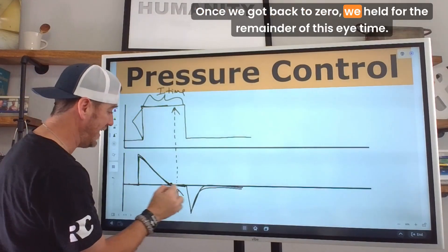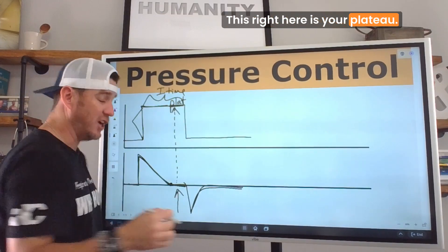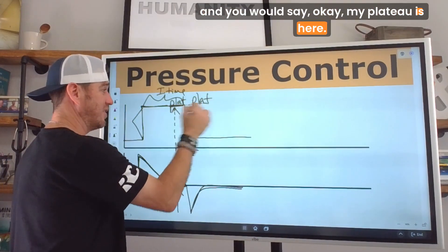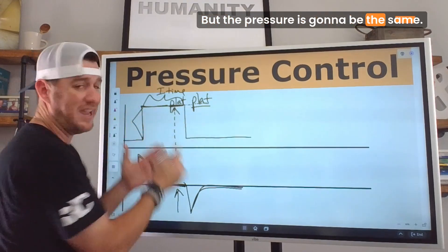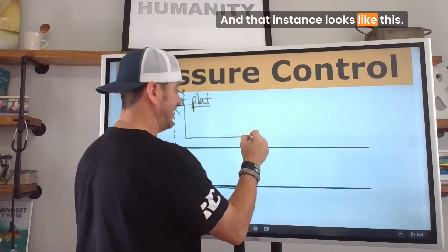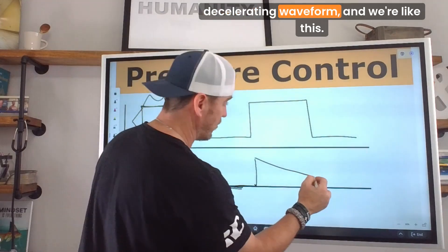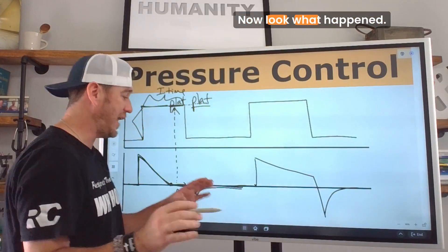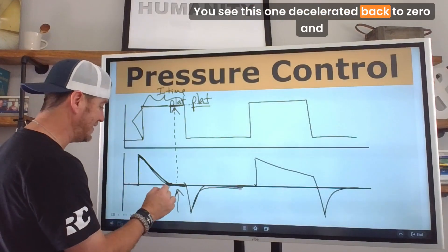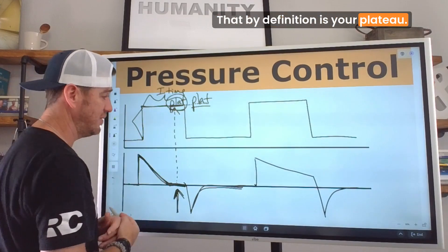During this inspiratory time, flow was moving and pressure was being sustained. Once flow got back to zero, the ventilator held for the remainder of that inspiratory time — and that right there is your plateau. If you do an inspiratory hold at the end of this breath, the plateau pressure value will be the same as the PIP. In the normal pressure control scenario, flow decelerated back to zero and held — which by definition is your plateau.